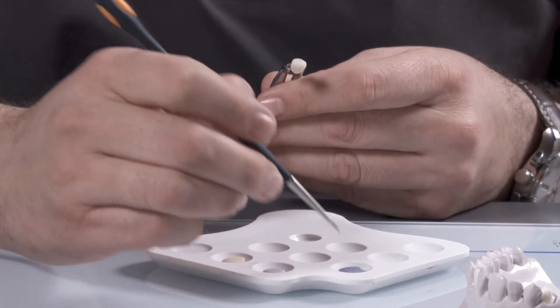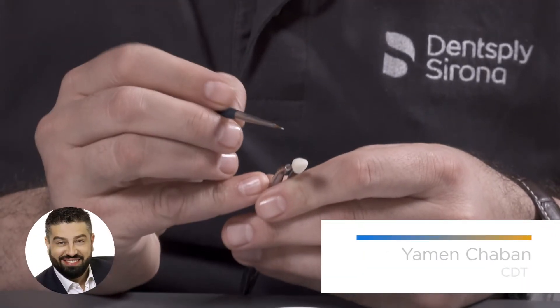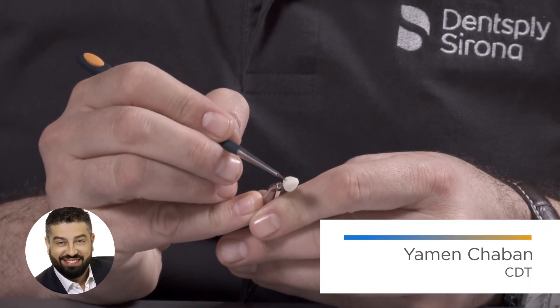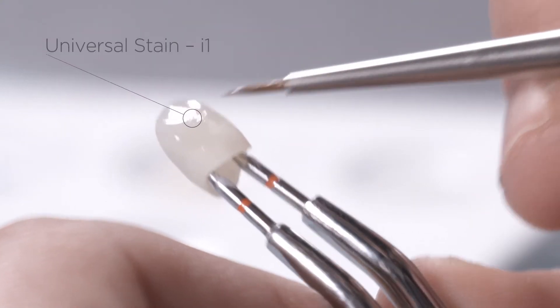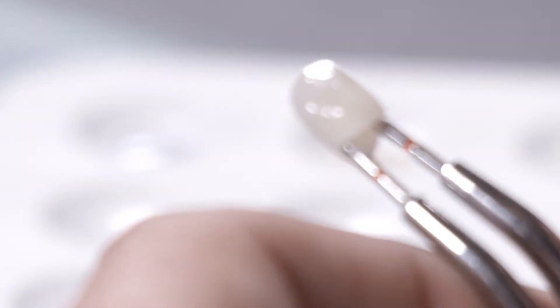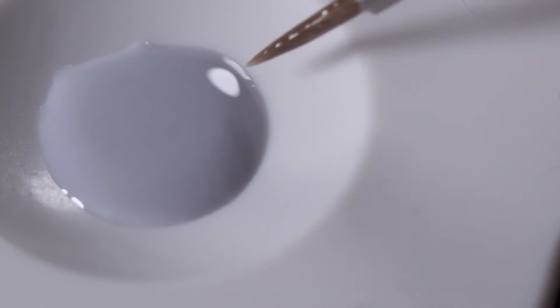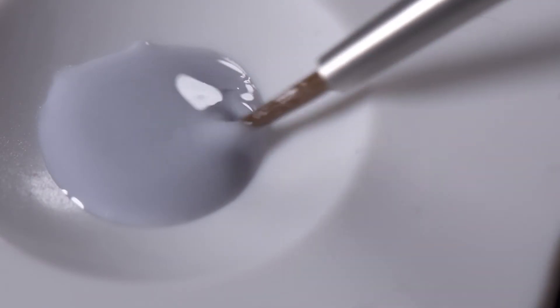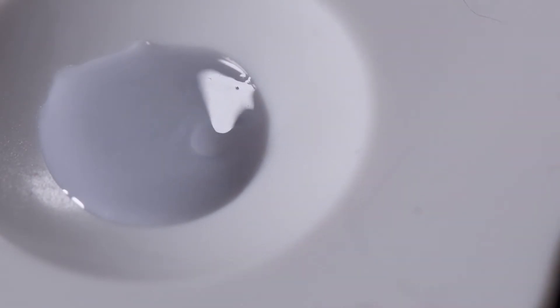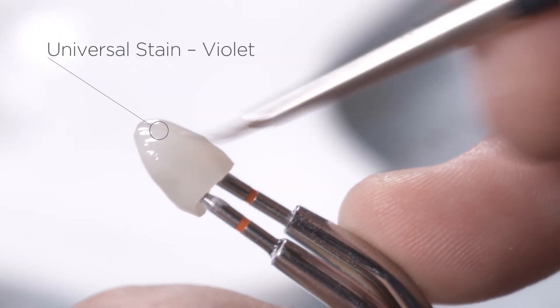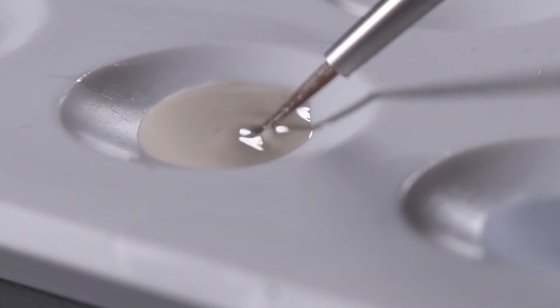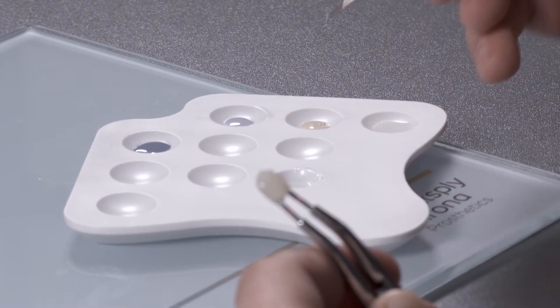Customize the mesial and distal ridge areas with incisal stain I1. Customize the mamlon structures in the incisal area with cream stain. Then highlight the areas between the mamlons with some violet, and characterize the mamlon structures in the incisal area with cream stain.